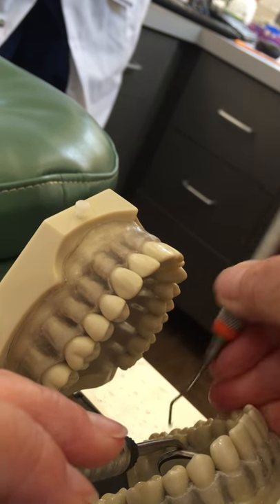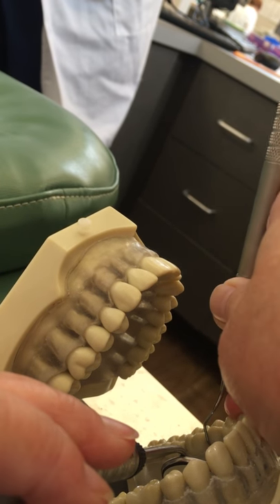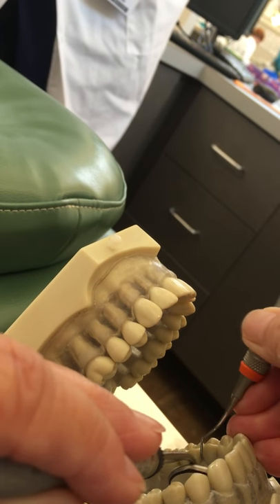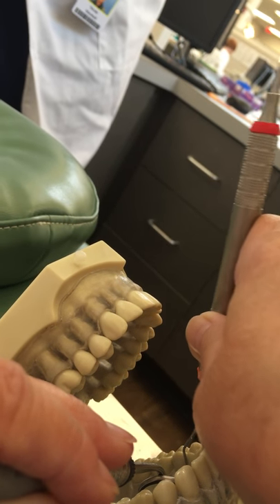Your shank is going to tell you what your working end is doing. You want to roll every stroke toward the tooth and go as far across that proximal surface as you can.